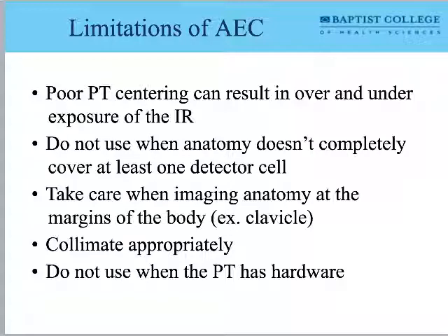So anytime we're using an AEC, it is worthwhile getting appropriate patient history. Have you had any surgeries in the past? Especially, like I'm doing an x-ray of your hip. Have you had any hip work done in the past? Why am I asking them that? Well, I want to know whether or not I can still use the AEC for my exposure.